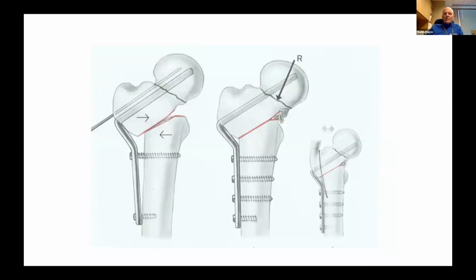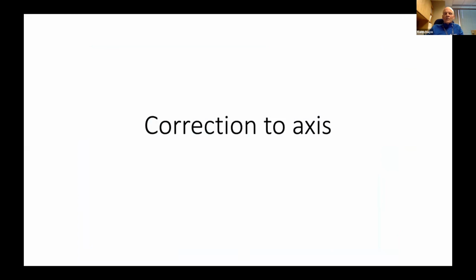Critical components of any kind of femoral plating are the ability to maintain compression across the osteotomy site. Roger's going to go over this more in detail, but you have to understand this concept, and it's critical to success in this situation.